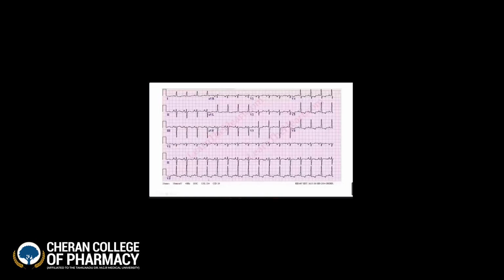The point is how to see whether the aVR is negative or positive. Negative means inverted, while positive means upright. If aVR is positive, that means the leads are attached in the wrong position: the V1 or anterior leads are attached towards the aVR part, and the aVR lead is attached towards the anterior part. This is something that happens in nursing practice.